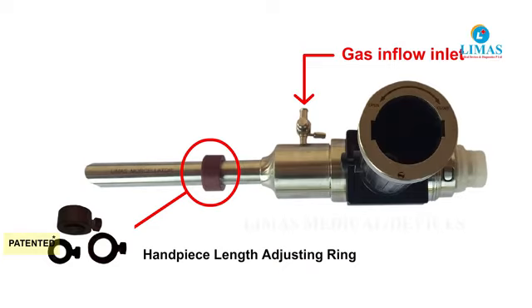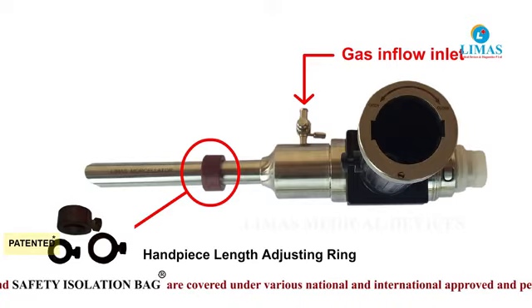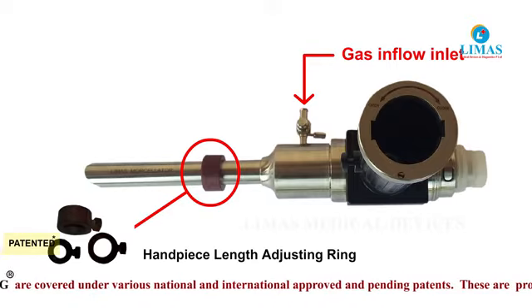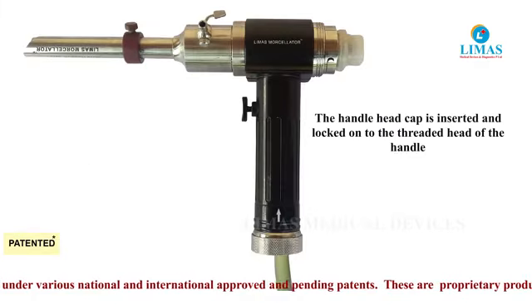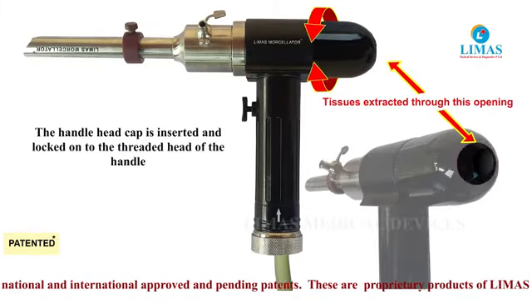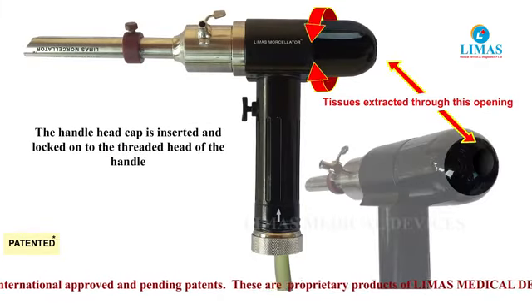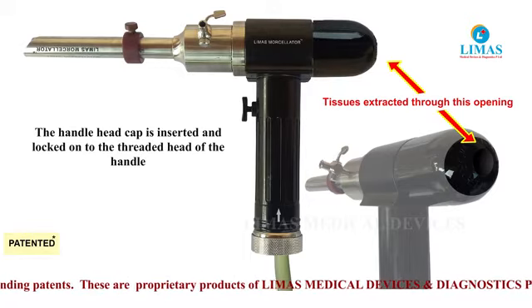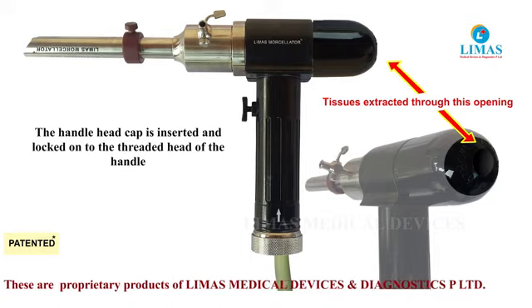The length adjusting rings are placed on the outside of the hand piece to adjust the length inside the abdomen. The back end of the hand piece is covered with the handle head cap. The tenaculum is passed and tissues are extracted through the opening on the handle head cap.